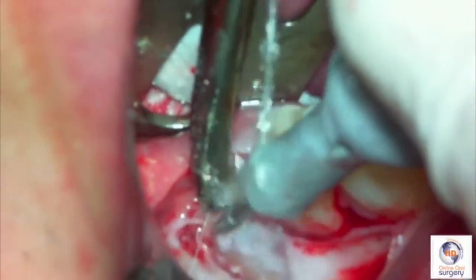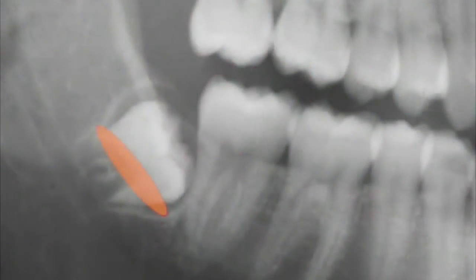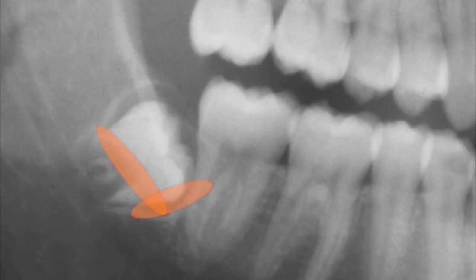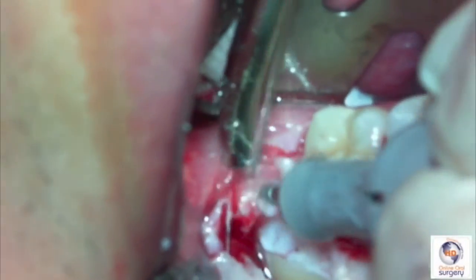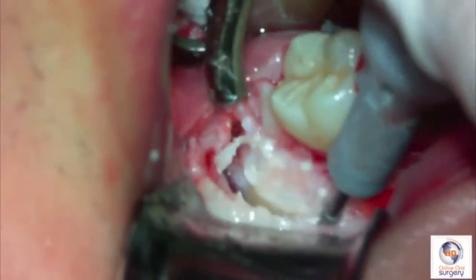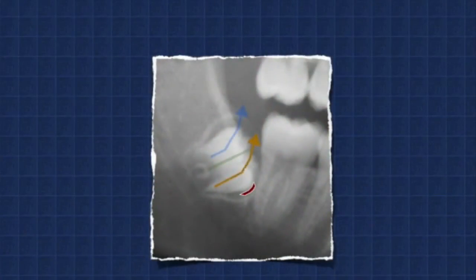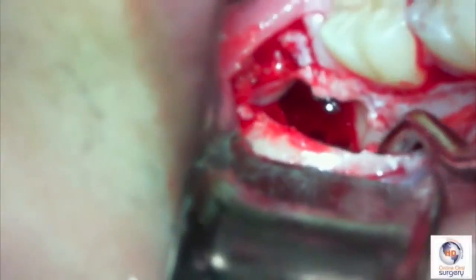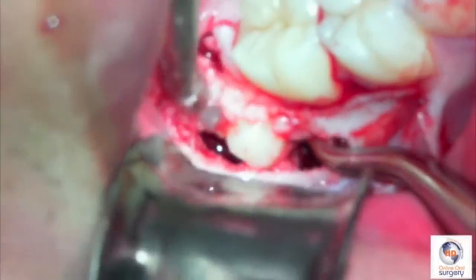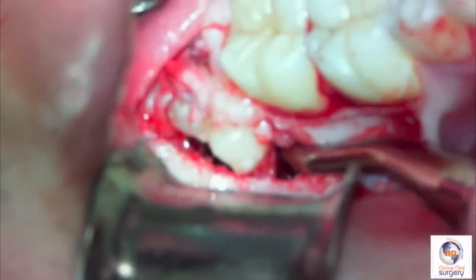I'm using a very light stroke, a very light pressure, and once I've found the margins or the border of the crown, I'm going to be sweeping away bone on the buccal aspect, and a little bit onto the mesial, basically creating what we call a trough. This trough is going to be carried all the way around the tooth on the buccal, a little bit on the mesial, and then distally we're only going to go as far as the central groove of the third molar. Then with the 46R elevator into that little mesial pocket that we created, place the elevator into there, and then very easily rotate the mesial half of the tooth, crown, and roots out of the socket.